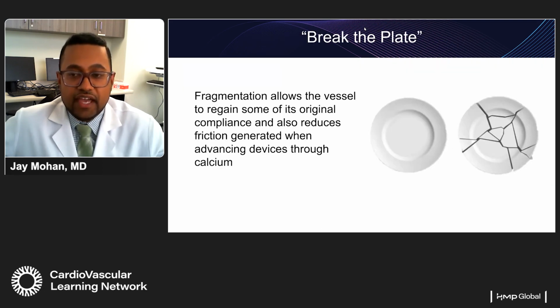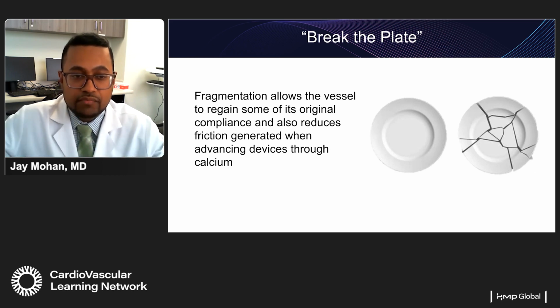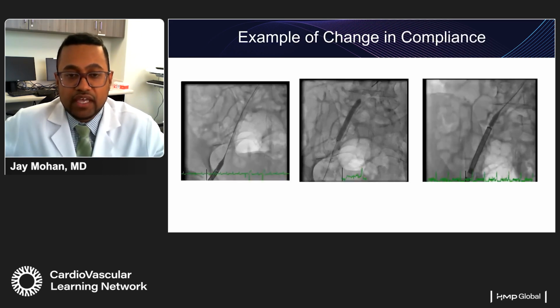So at the end of the day, it's basically like breaking a plate. And so you break and fracture these calcium, and I like to think of it as like tectonic plates, right? So you originally had this stovepipe, and now you have all these tectonic plates, and these little fractures fill in with fibrous tissue that actually give that vessel compliance and the ability to move. And that's where in large bore access it has become an amazing thing.